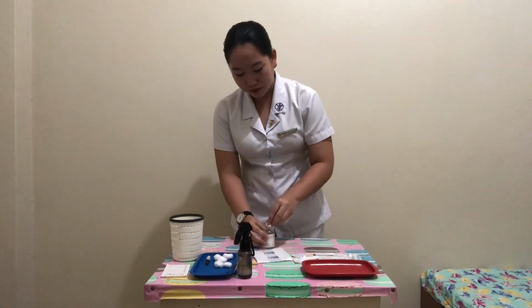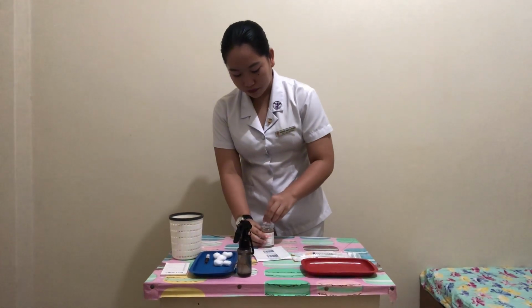And then remove the protective cap or clean the rubber cap of a previously opened vial with an antiseptic wipe by rubbing in a circular motion. And now to prepare the medication for the ID and SQ injection, we need to open the syringe and take it out. So remember to only touch the barrel and the plunger of the syringe to avoid contaminating the needle.